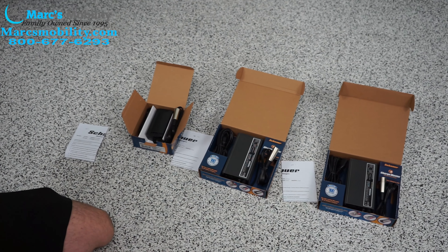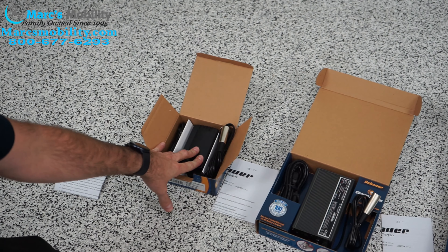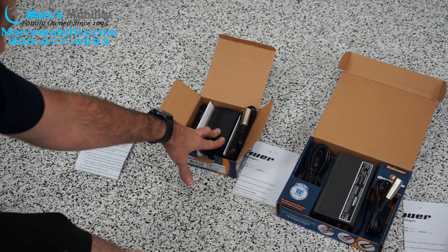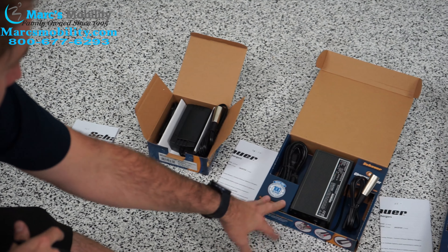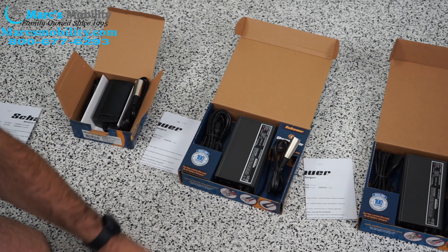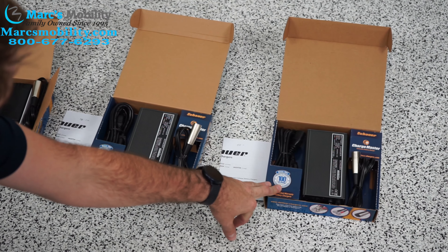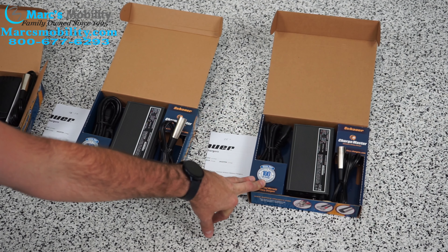There are three basic types of chargers for power chairs. Your 2 to 3 amp charger is going to be for your 22 amp batteries up to around 30 to 35. Then you have your 5 amp charger, which is going to be for your 35 to 50 amp batteries. And then you have your 7 to 8 amp charger, which is for your 55 amp batteries and anything over that, like 75s.